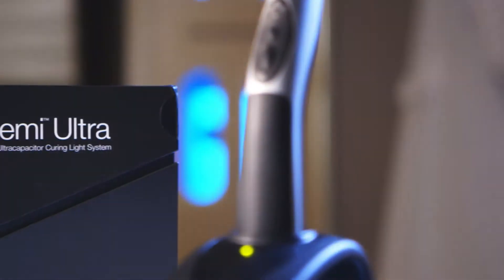Hi, I'm Dr. John Fluckey. I'm technology editor for Dental Products Report magazine, and I'd like to spend a couple of minutes talking to you about a new curing device from Kerr called the Demi Ultra.